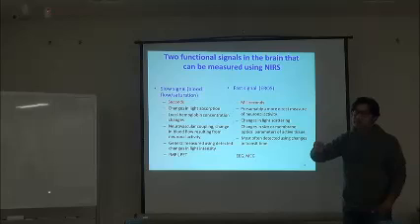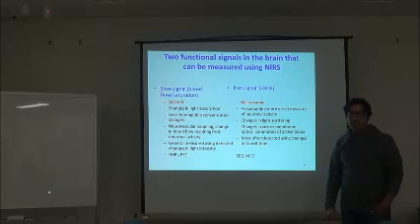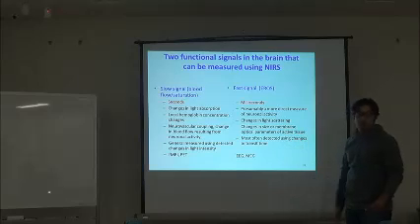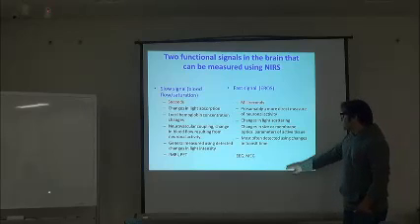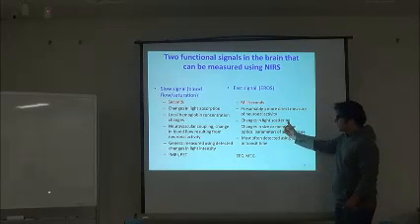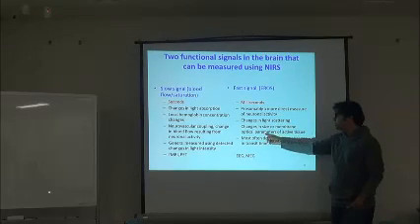Because of that, the optical properties of the membrane of the neuron and the surroundings change, and we try to detect those optical properties and get some signal out of it. That is called the fast optical response, event-related optical signal, or sometimes the neuronal optical response. So as it is written here, it detects the changes in the light scattering, changes in the size of the membrane or the membrane optical properties.